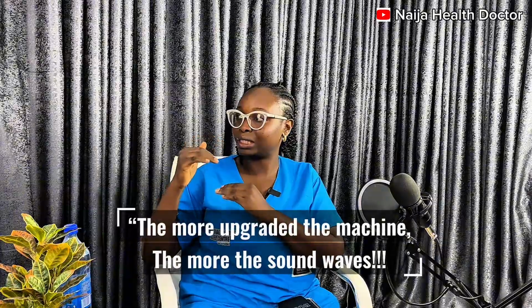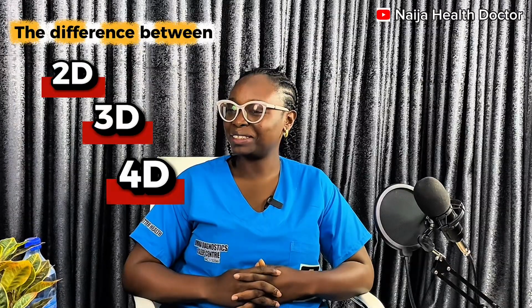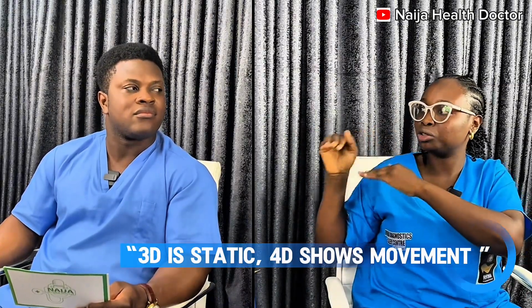The more upgraded the machine is, the more sound waves it sends to the child. The difference between the 2D, 3D, 4D. Sometimes we convince these patients to do 2D, and that is what is medically essential. It's more clearer. It's like a real life image. 3D is static, so 4D is just 3D showing movements.